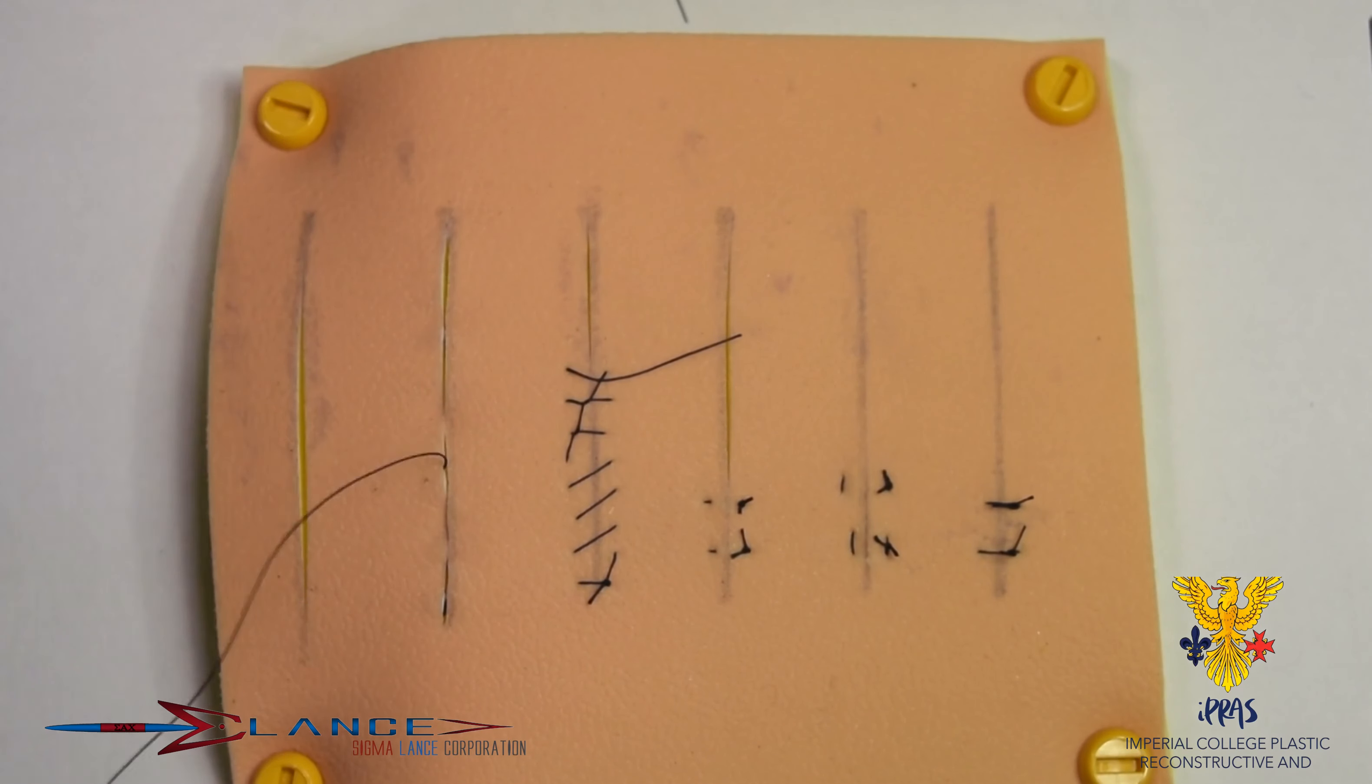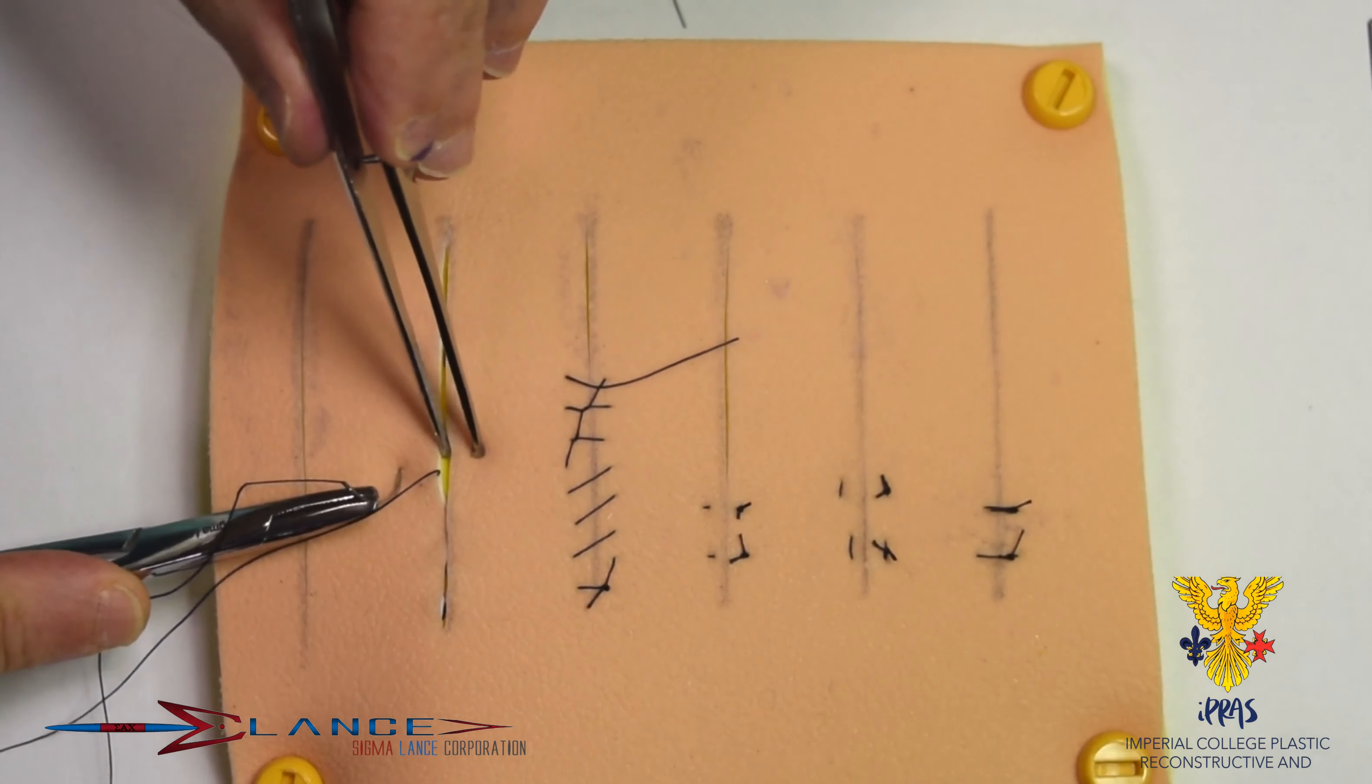And you can see how much better the skin's coming together. And the closure essentially proceeds in this manner.